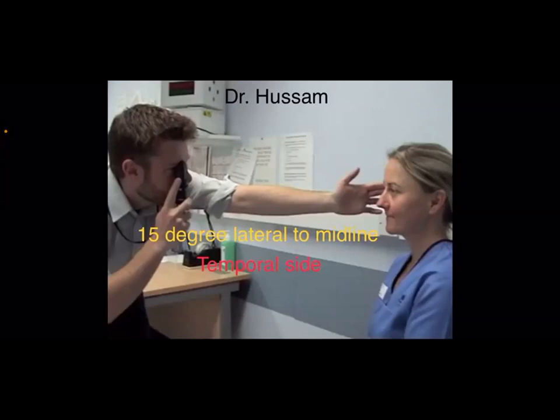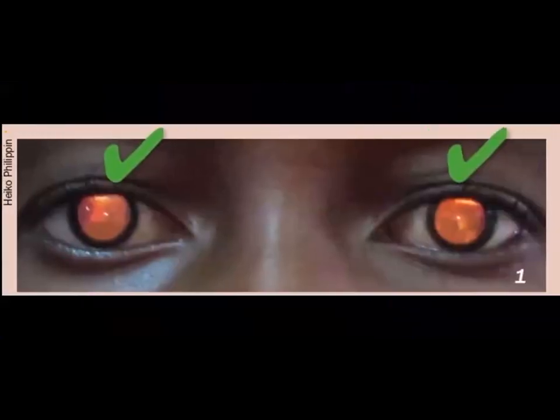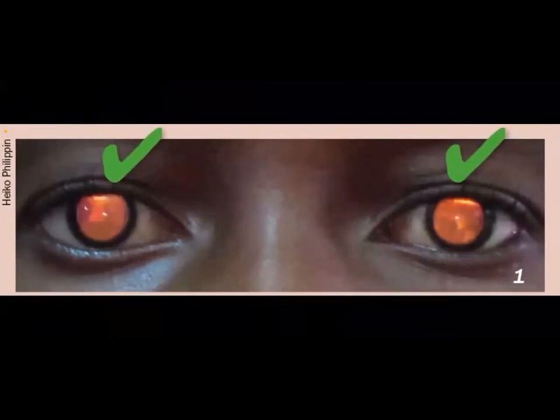What you will see is this image. The retina will reflect the light back. You will see an orange color like this. This is normal bilaterally. Normal red reflex bilaterally. What does it signify? This is normal, and there is no problem. Nothing is between your ophthalmoscope and the retina.